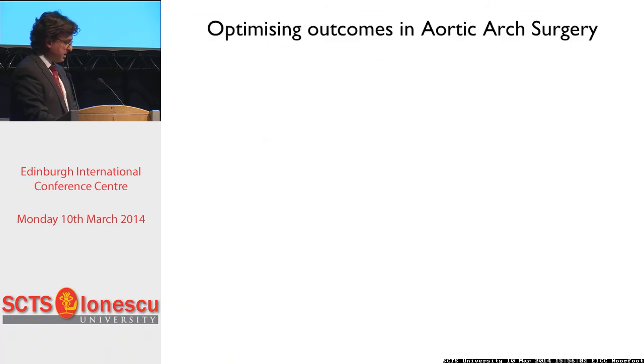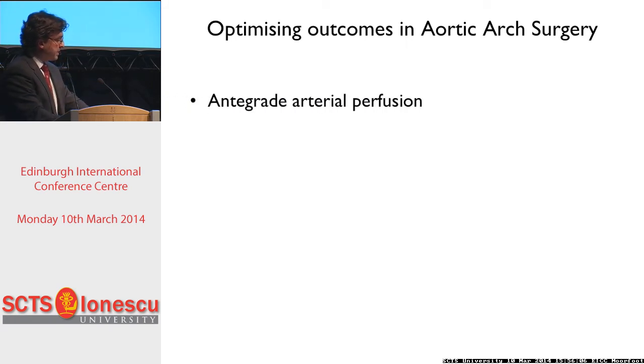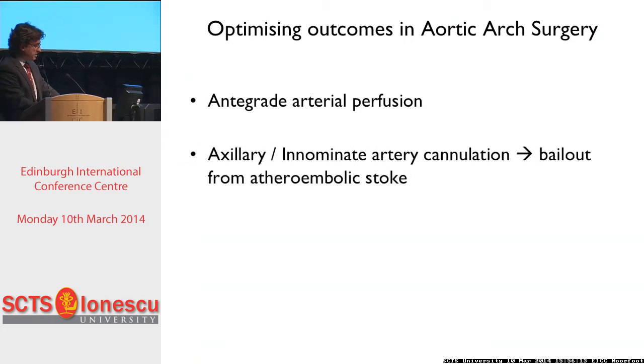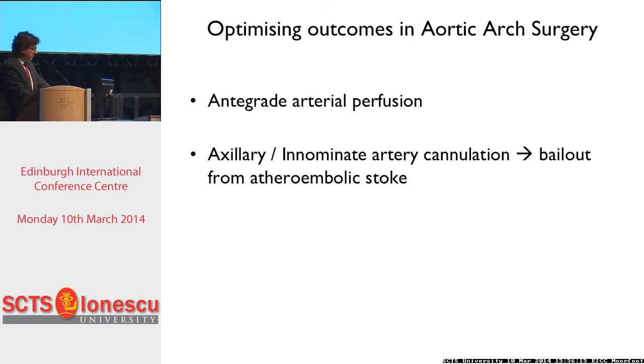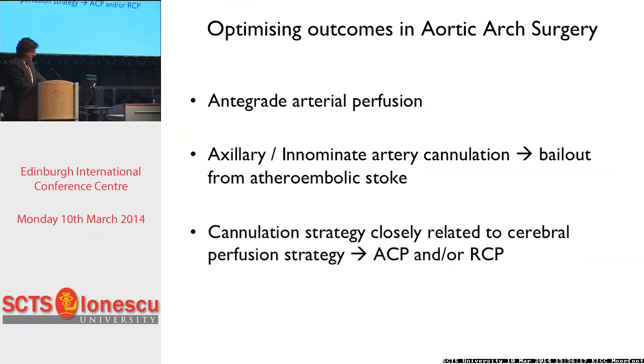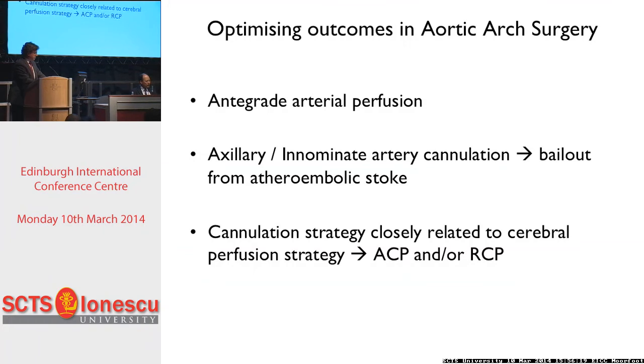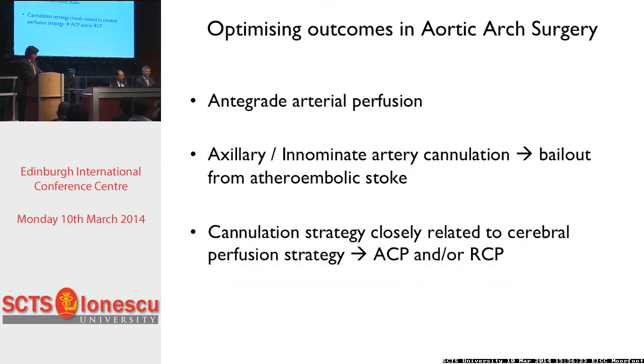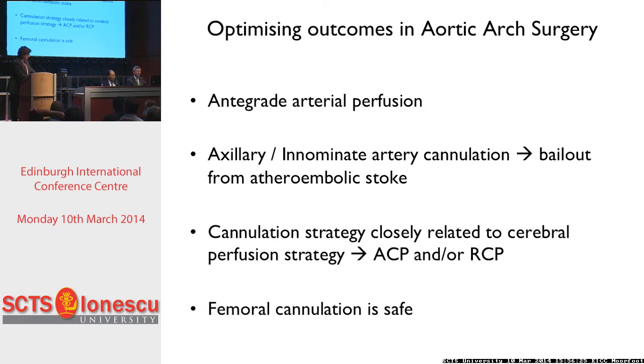So in order to summarize, for cannulation strategies in aortic arch surgery, aim for antegrade arterial perfusion. Axillary and innominate artery cannulation can bail you out from atheroembolic stroke. The cannulation strategy is closely related to cerebral perfusion strategy, which can be antegrade, retrograde, or both. And femoral cannulation is safe.